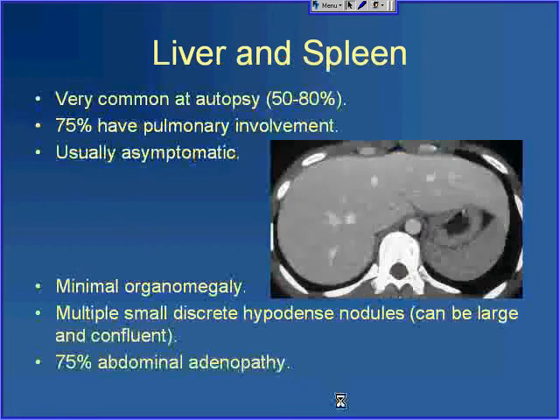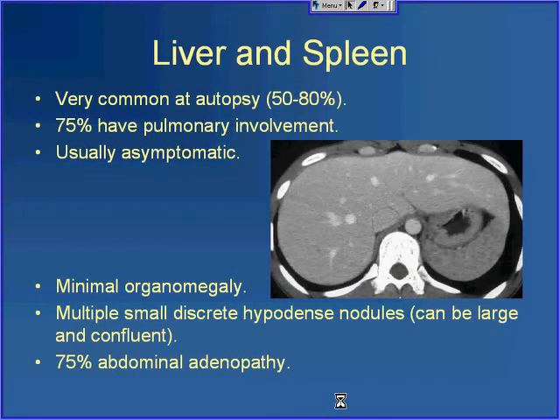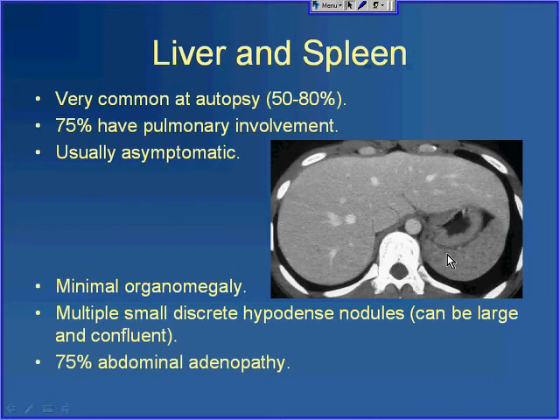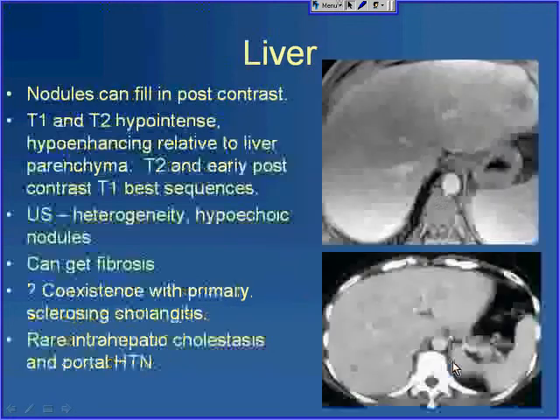Liver and spleen involvement is actually quite common — up to 80% of patients at autopsy will have liver or spleen involvement. Most of these patients will also have lung involvement. We don't image it very often because it's usually asymptomatic. The most common finding is minimal organomegaly, but patients can have multiple small discrete hypodense nodules, as seen here in the spleen. Most of these patients will also have abdominal adenopathy. The nodules can become quite large and confluent, appearing very nonspecific.